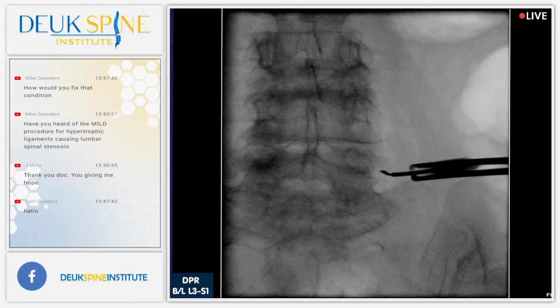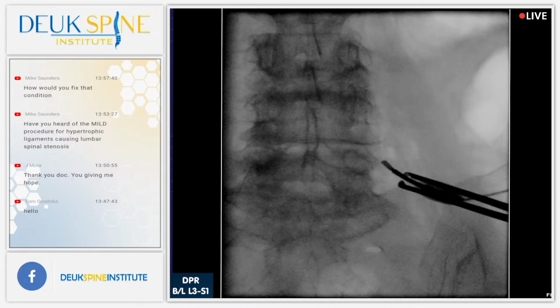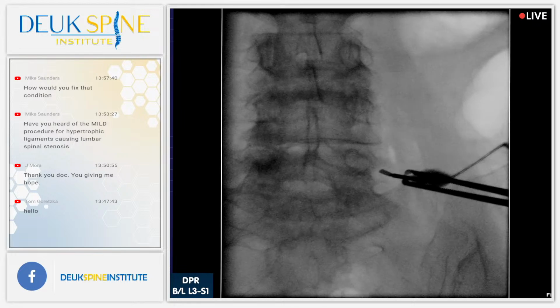So I'm burning the medial branch of the dorsal ramus. Once again, keep your eyes open for our new website, and when you see it, there will be a section on the discs, and there will be a section on the facet joints. And you can actually see on the discs where the annular tear happens, how it causes pain through inflammation. And on the facet joints, you'll see the tears in the capsule and how they cause pain and how we fix them. So it'll be really informative.